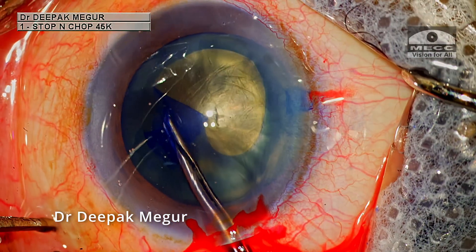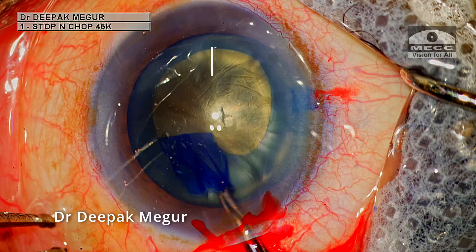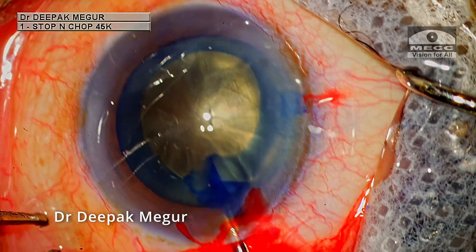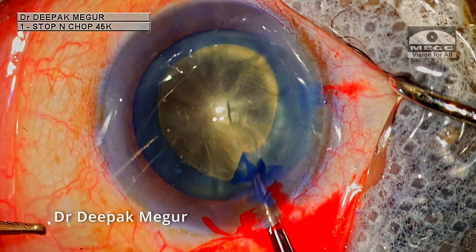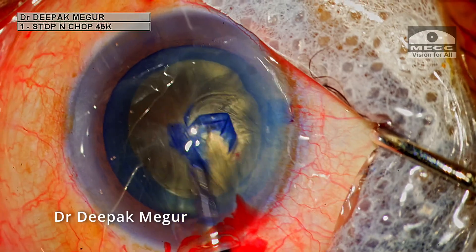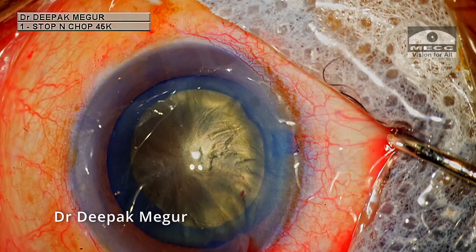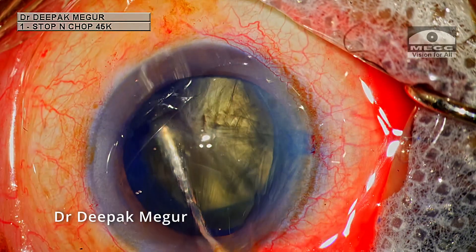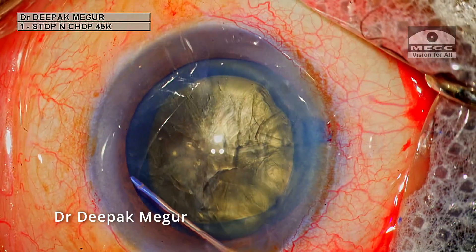Of late, I've been preferring to perform an oval rhexis where the diameter of the rhexis in the meridian of the incision is more than the meridian right angle to it. I learned this oval rhexis from Dr. Kiranjit Singh from Amritsar, India. I find that this oval rhexis helps to create a longer trench, which indirectly helps in easier division of the nucleus — and nuclear division is probably the most difficult part in such cataracts.